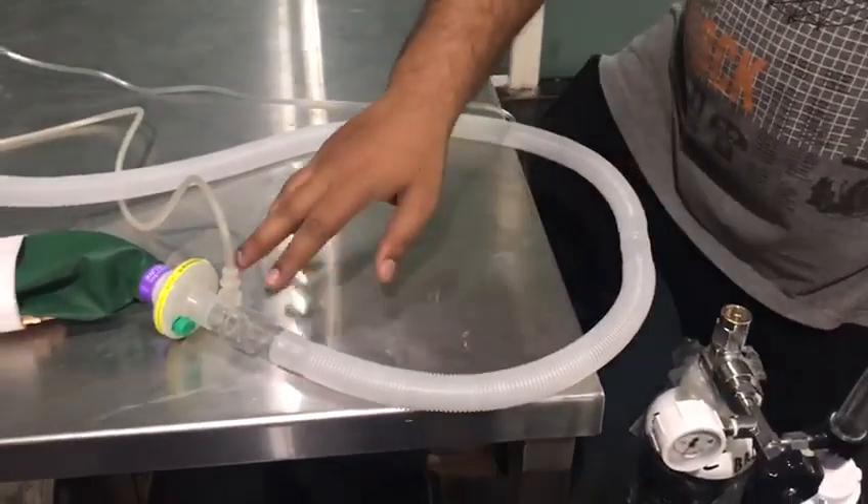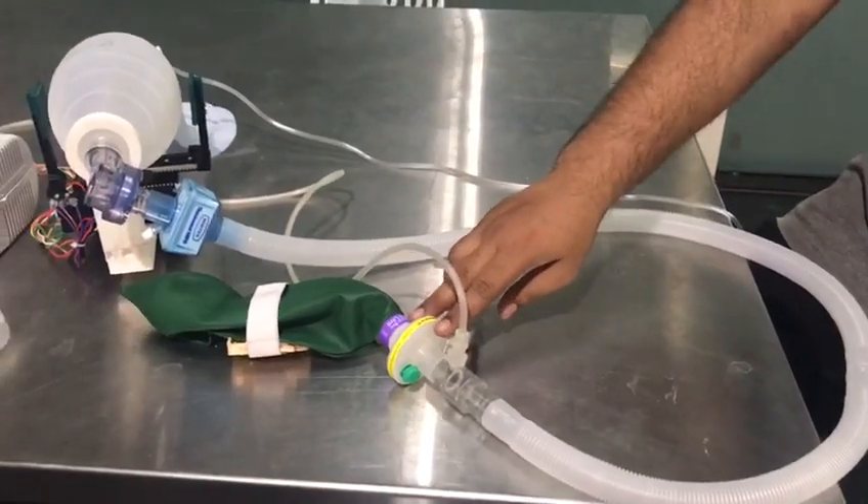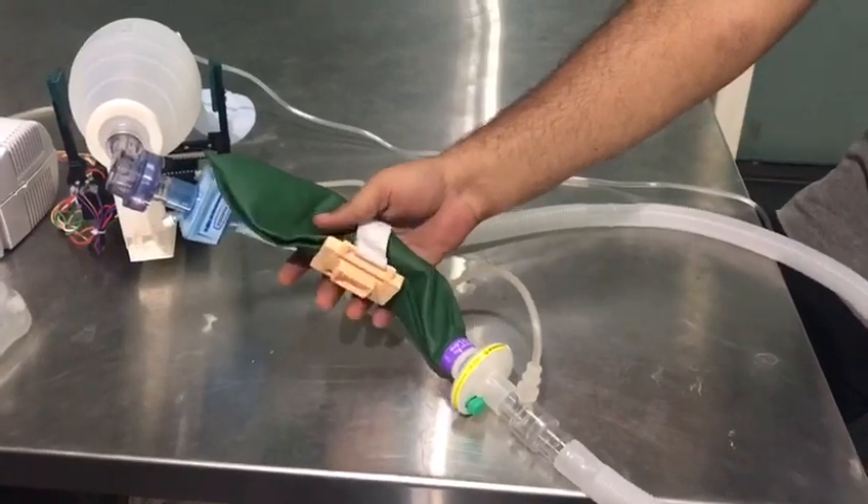Through the line there is a second tube which goes through to the pressure sensor. There is a heat and moisture exchanger, and this is a reservoir bag that we are substituting as a test lung.